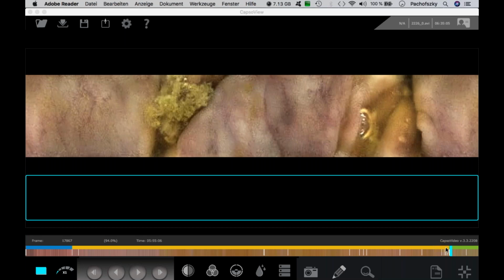Okay, thank you. There is one more question. How much time should I have to completely read this film? This is from Egypt again, Dr. Walid. Yeah. It depends on your expertise. How many cases you've seen. This is a totally new kind of view to the mucosa. So you need at the beginning, I will say 20% more time to find in this new viewing mode.